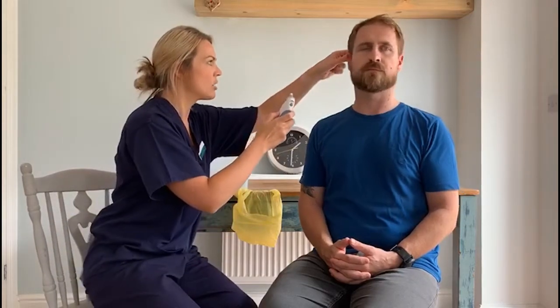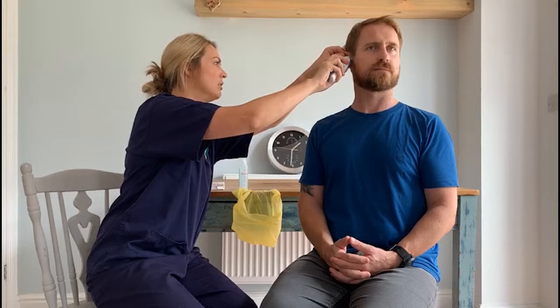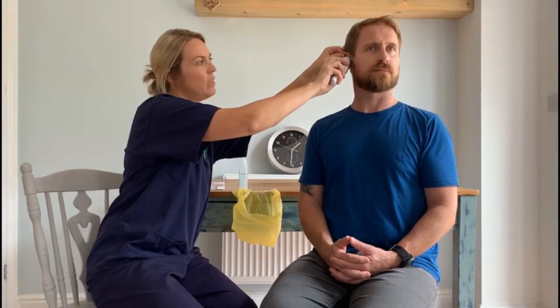Before starting, you always need to use the plastic cover. So put the plastic cover onto the thermometer without touching it with your hands. I'm going to then place this in Dan's ear, so I'm just going to pull up and back slightly on the top of his ear, put this firmly in the ear canal, and then mine's got a button at the top here, and then it has a green flashing light, and then there's a long continuous beep which just indicates that the temperature's been done. This has come up with, on the display here, 37.3, so that is a normal temperature within the normal range, so that's great, thank you very much for that, Dan.